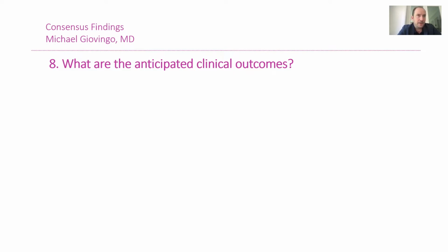Again, we know what the low settings are that don't work. We know what the standard starting settings should be. And we are slowly exploring the higher settings. We have some boundaries that are described in the literature, but that was described with the old probe, and it's the consensus of this group that the new probe has a better safety profile. So I think the upper limit we will define in the near future. So the short answer was that you'd increase total treatment time and then secondarily slow down sweep speed, right?